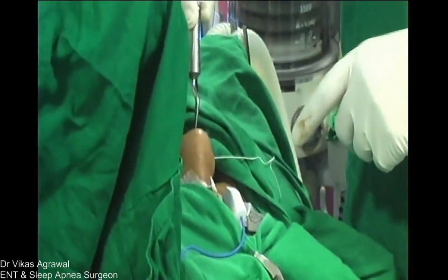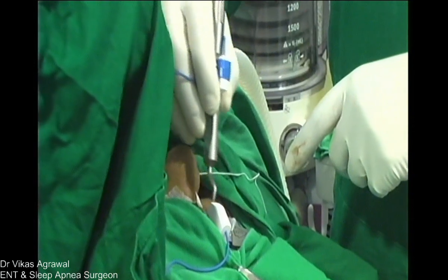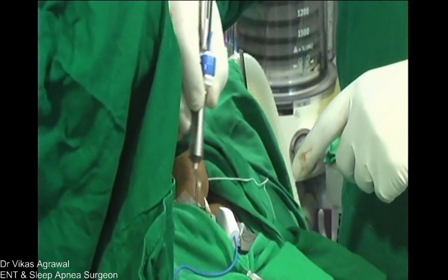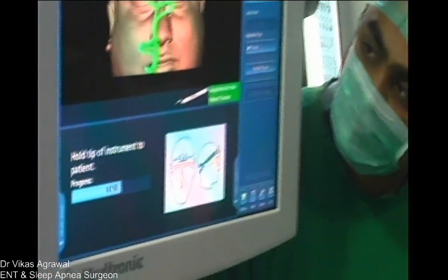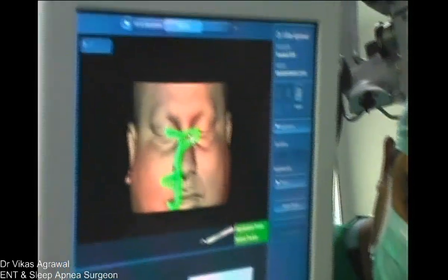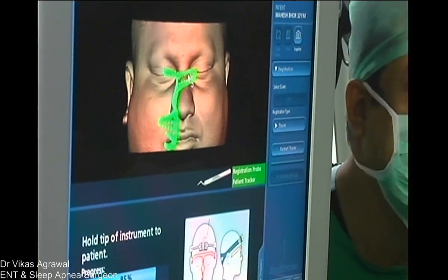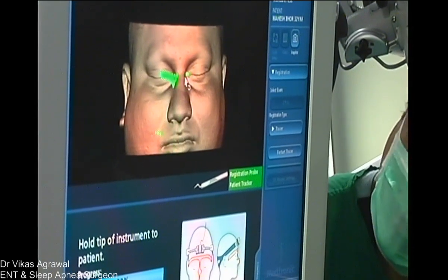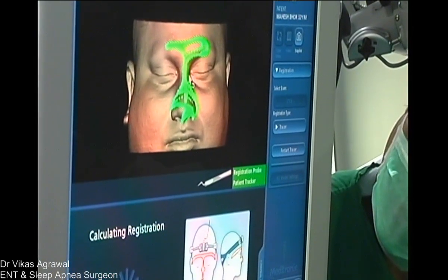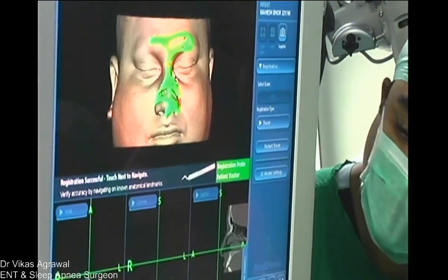It's not taking. It's just not taking. So there is some technical issue here. I'm just trying to track. If it takes, fine. Okay. Now you show it there. Now see. So whatever I tracked, it has already taken.